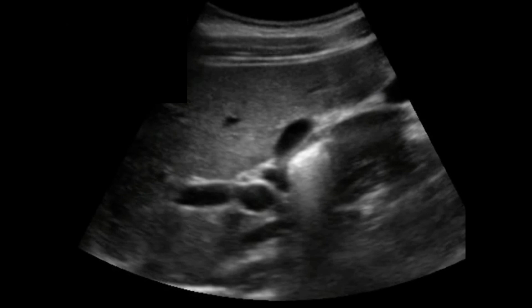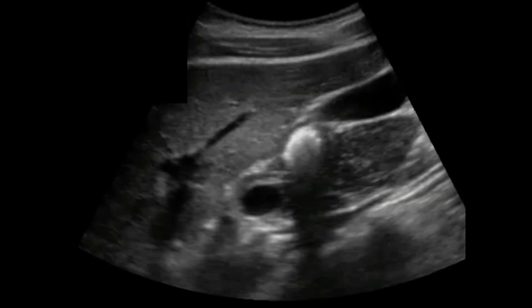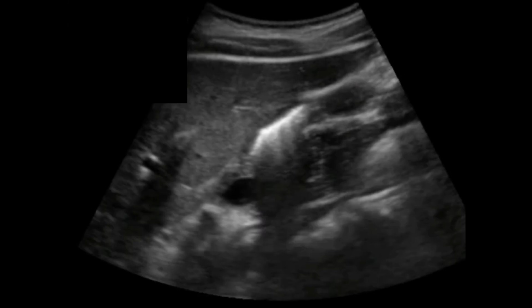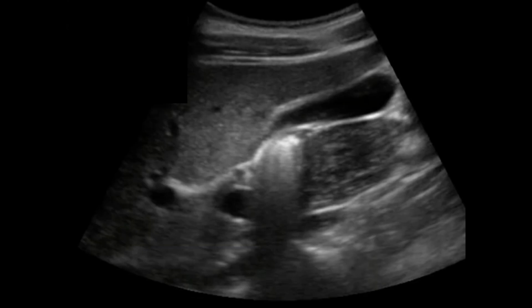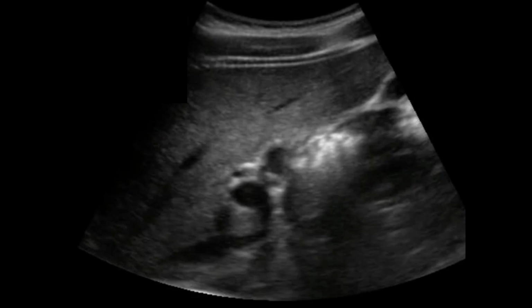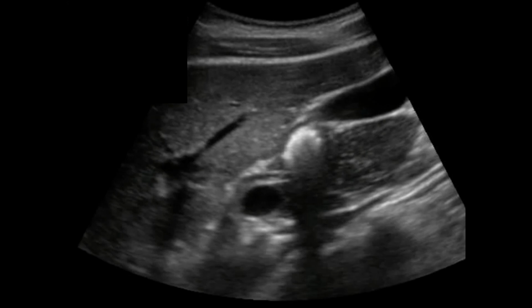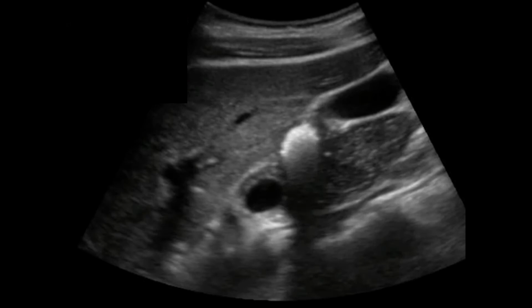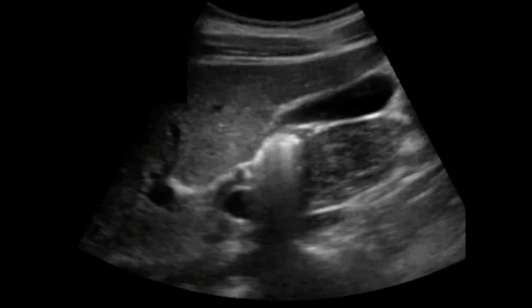This can be a fake out here. Notice your gallbladder is that oblong structure in the top right of your screen. You can see it feeding down, and that bright white structure right underneath it can often be called the gallbladder. That's actually your duodenum full of air. That's not stones. It's your duodenum full of air, but it can often be sitting right there where the gallbladder would be. So just be on the lookout for bright white structures. That's going to be more likely air-filled structures, or the intestine, in this case your duodenum.